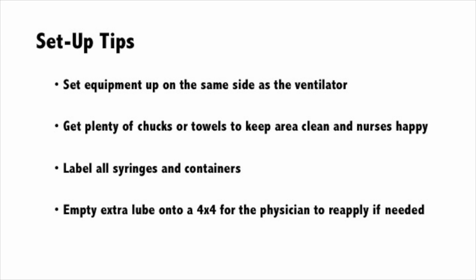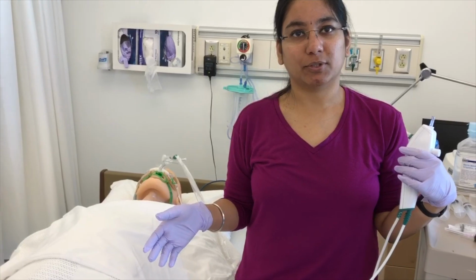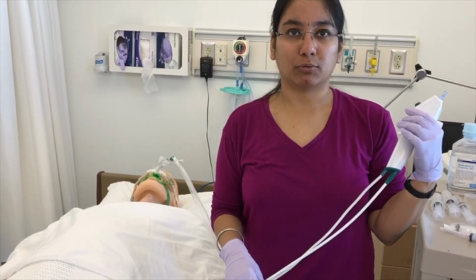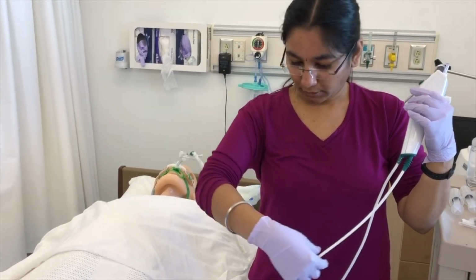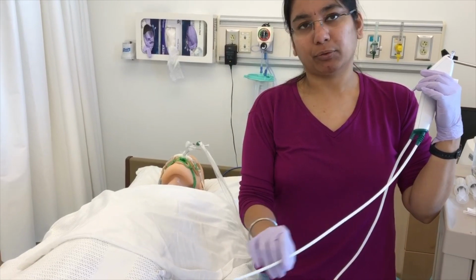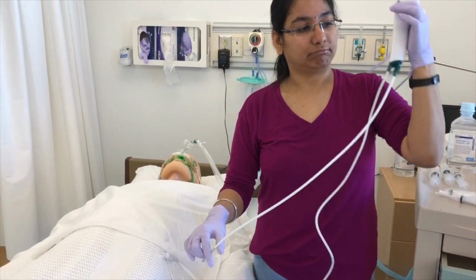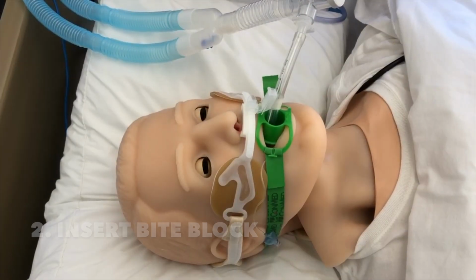And now let's go back to Saranya to discuss the necessary steps to set up for a bronchoscopy procedure. So remember, bronchoscopy is a sterile procedure. So all the equipment setup, basically the bronchoscopic setup, should be maintained in a sterile field. So we have to lubricate halfway through the bronchoscope till the distal end and hang it so that we can wait for the physician for the procedure.